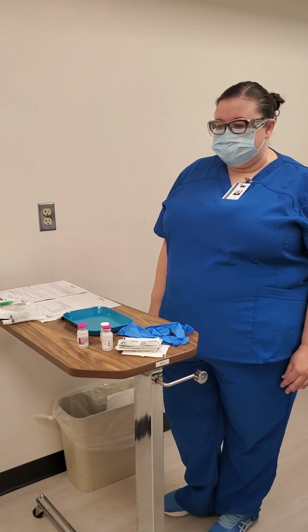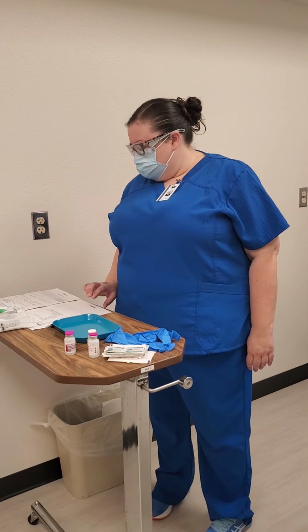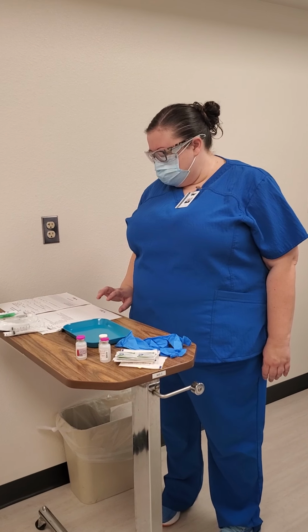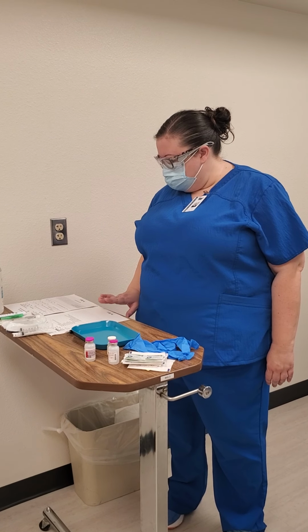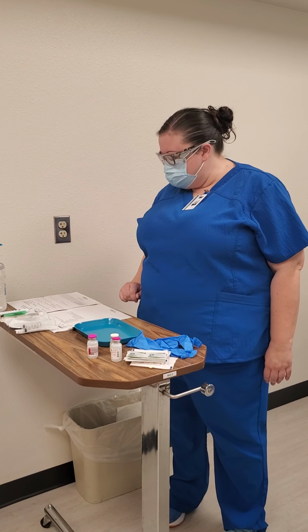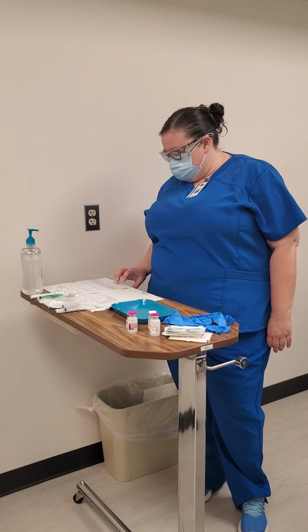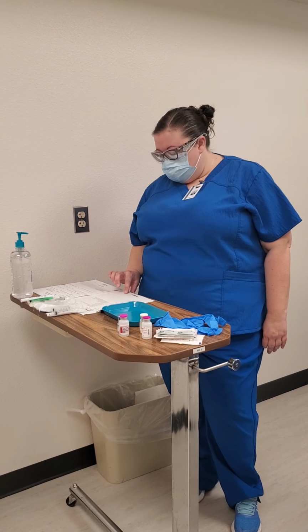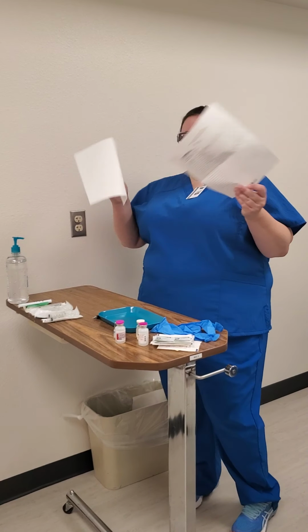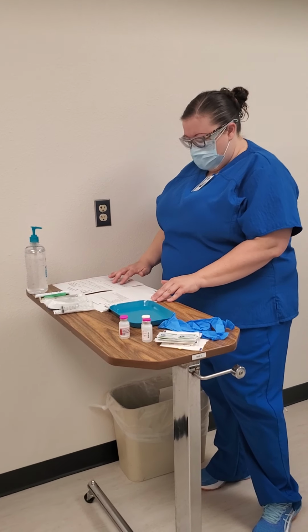Hi, I'm Tara Johnston and I'm a nursing student, and today I'm going to be demonstrating an injection skill. I'm going to be administering a TB test and also an intramuscular injection using the Z-track method. I'm going to show you the backs of my paper so that you know there's nothing but the doctor's order and the MAR.